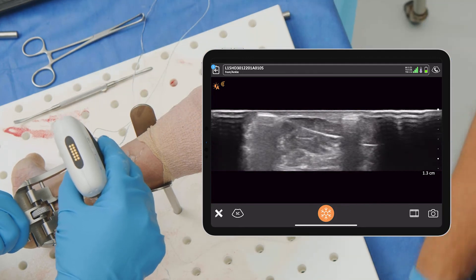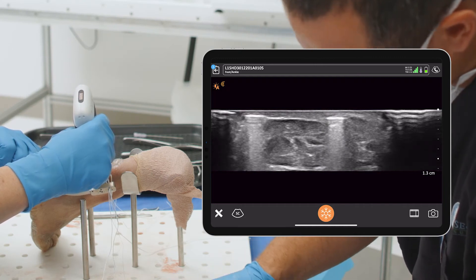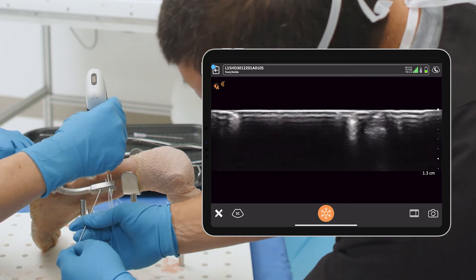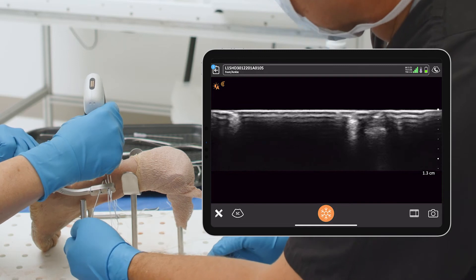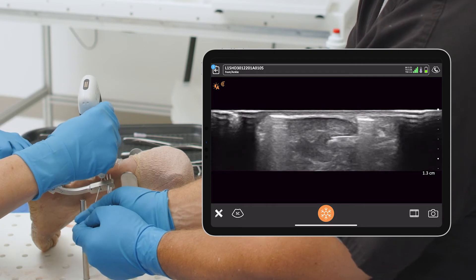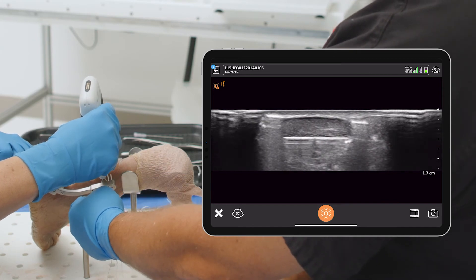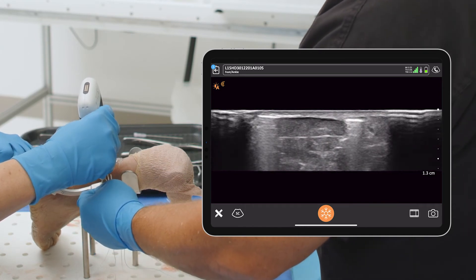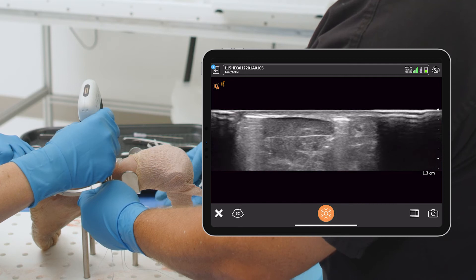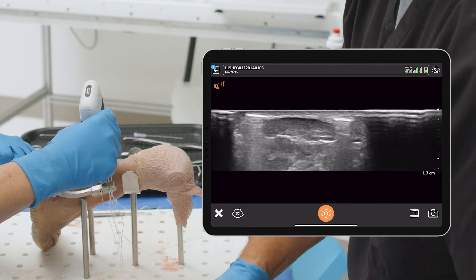In this technique we're passing four sutures percutaneously, and you can see there'd be no other way to identify whether you're in the right spot without ultrasound. I've hopefully made this in the right spot — go ahead and pass that through. It's going through just perfectly, that's dead middle. Beautiful. Pull that all the way through. Great — equalize the length.